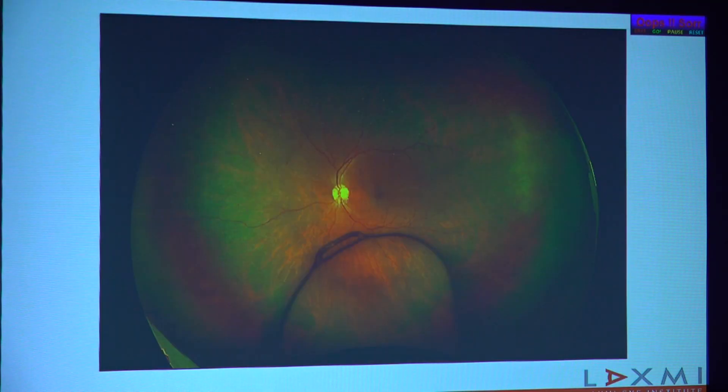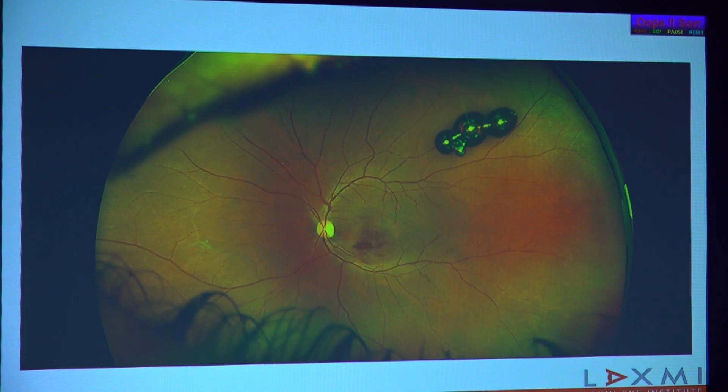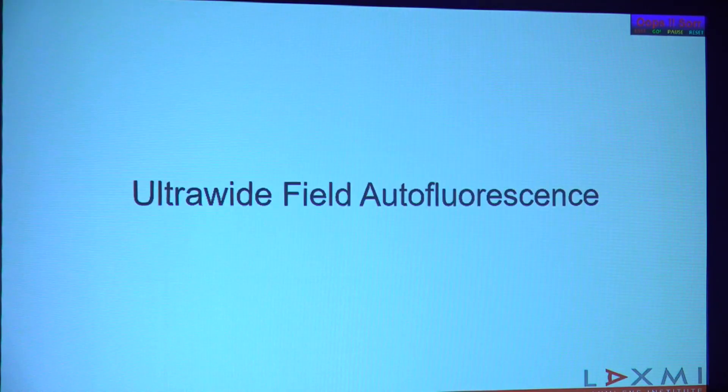I've shown some of these images before — this is a series of dislocations of structures into the vitreous cavity. This patient, after an anti-VEGF injection in which a few air bubbles had also gone in, was very concerned because he was seeing circles. We were able to reassure him that they are nothing but air bubbles, which will disappear in a few days.